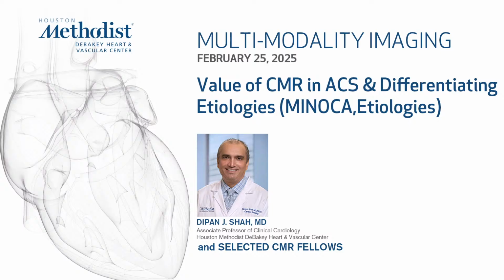Sharing interesting cases on the use of cardiac MRI in the setting of patients that are presenting with suspected acute coronary syndrome. So our first case presenter is Layla Gamash, and Layla's going to give us a very interesting case. Layla? Thank you.